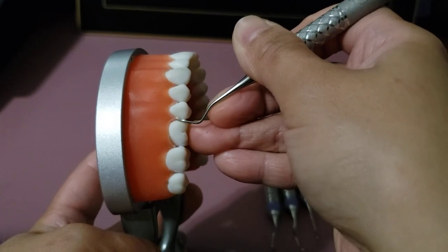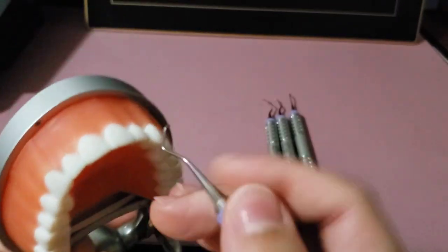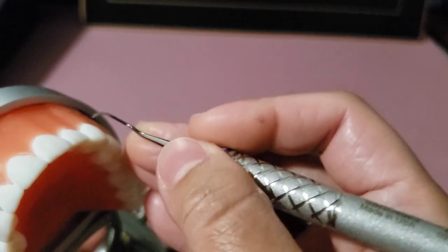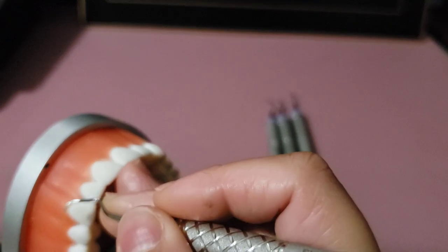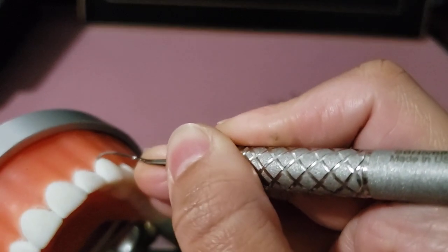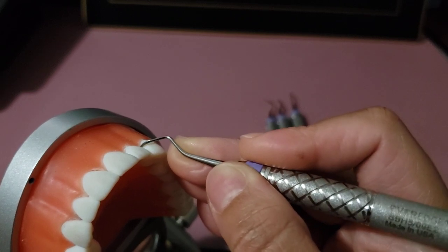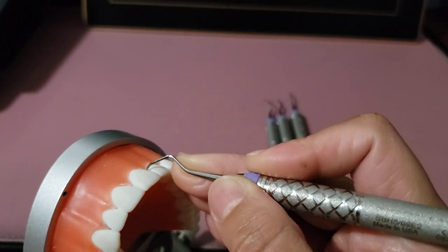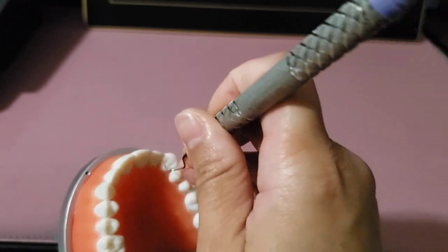For anterior teeth, always confirm the correct working end by placing the bump against the tooth. Working on facial surfaces with the bump against the tooth confirms the correct working end. Start canine to canine with just the toe-third inserted at the midline. Close, insert, open away, then rock and roll almost right away to avoid lacerating tissue. Continue with the next teeth: close, insert, open away until fully in the proximal. For lingual surfaces, flip the instrument so the bump is still facing the tooth.